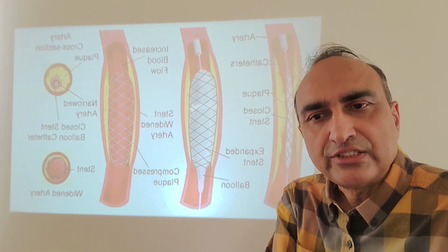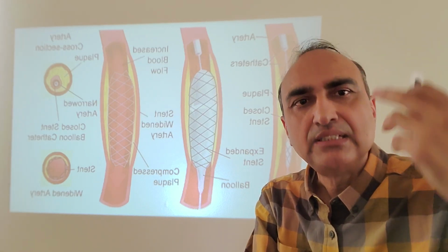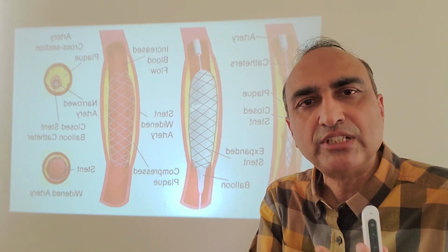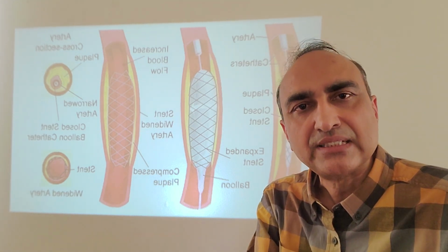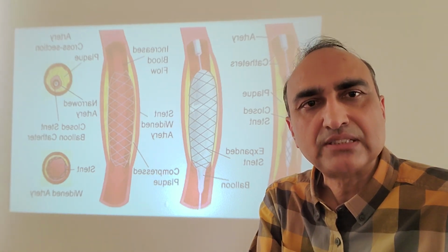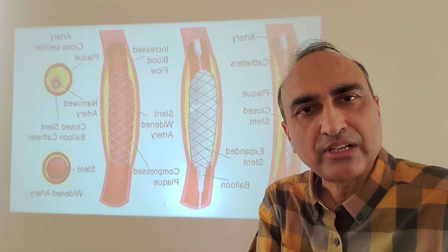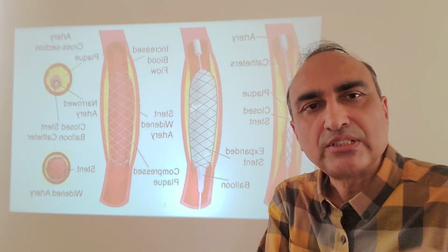As you know, the vessels go all around the body. They can go to the head and neck. So the neck vessels are also quite big, almost 6 or 7 millimeter. And then the same vessel goes to the arms and legs. So we, as interventional endovascular specialists, are now able, with the blessing of Almighty, to actually fix those vessels wherever they are.